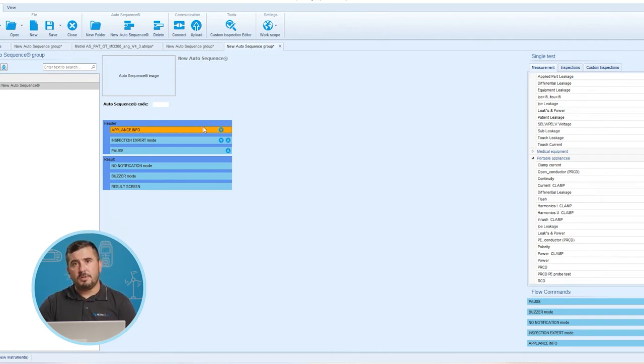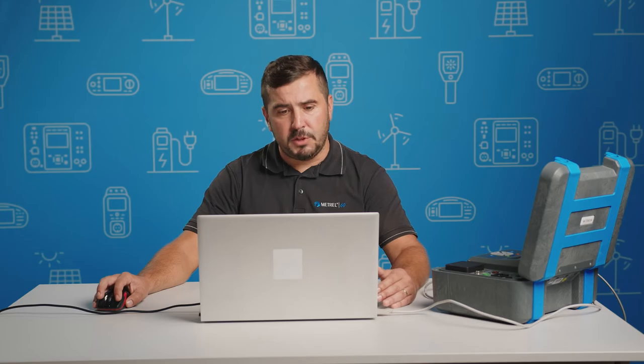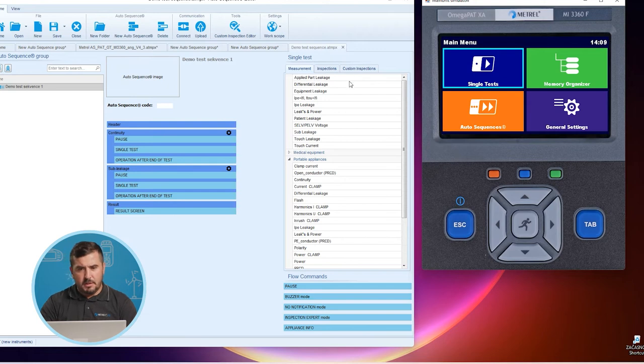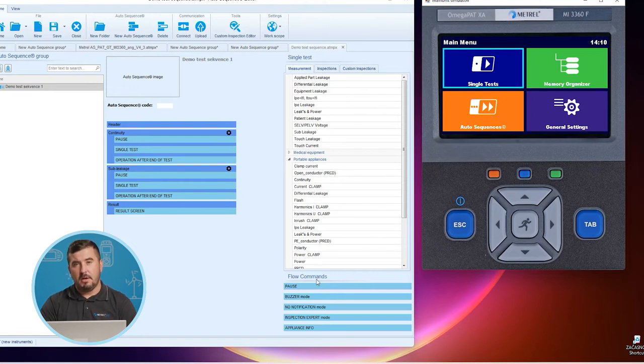Let us now focus on the test sequence we will build ourselves, which we will also check on the instrument simulator and use to explain some elements of the sequence. I will put both applications side by side so it will be very obvious what will happen on the instrument and what kind of flow commands we will use. We will create three different auto sequences to see what the main purposes of these flow commands are and how they actually behave.